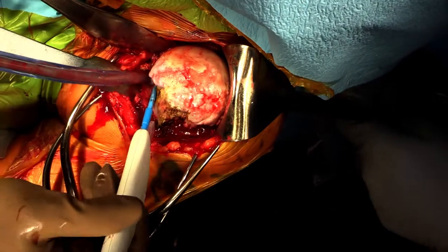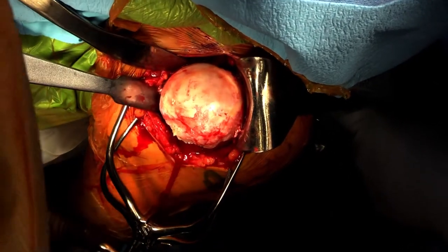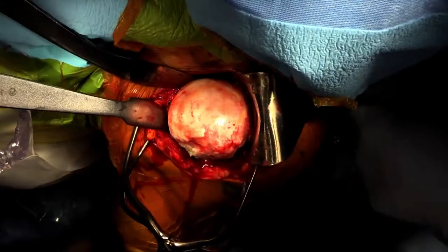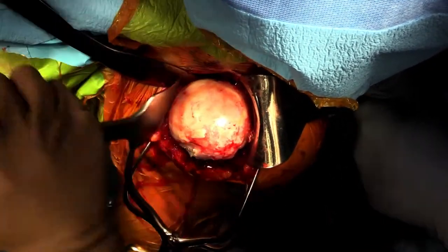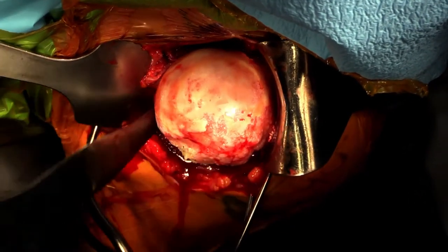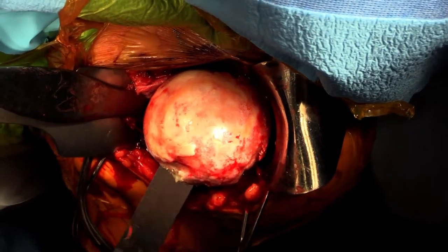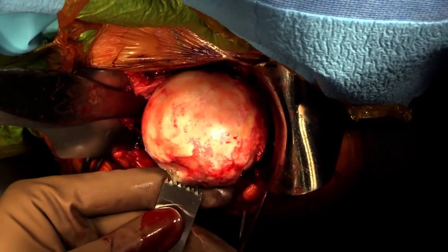Arm position is crucial during the humeral head resection. Extend, adduct, and externally rotate the arm. This will provide access to reach the 7 o'clock position. Replace the narrow Hohmann with a wide Hohmann to help expose the humeral head. Make the cut distal of the anatomic neck of the humerus, about 2 to 5 millimeters.